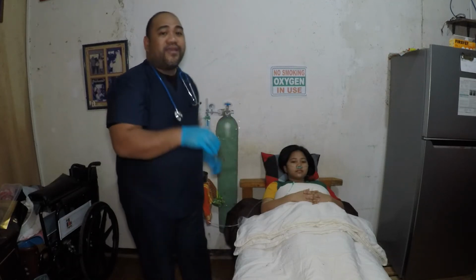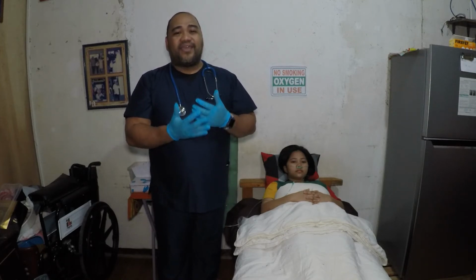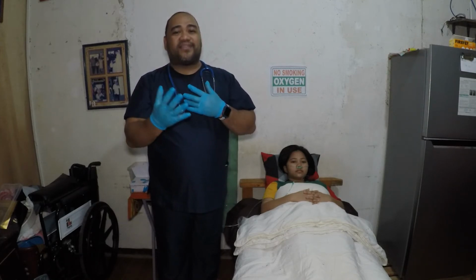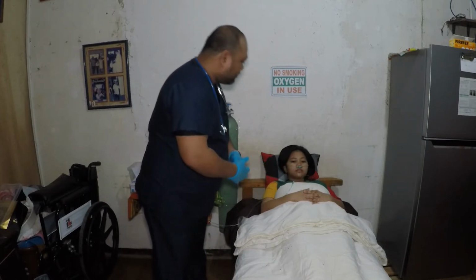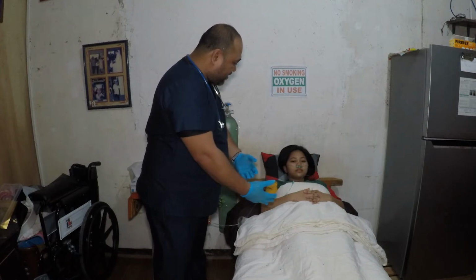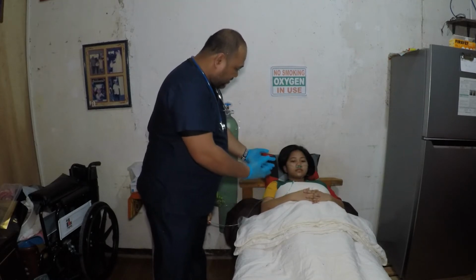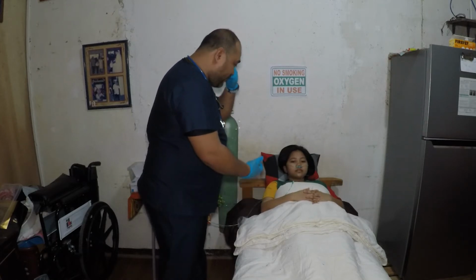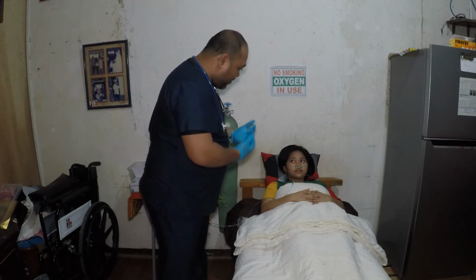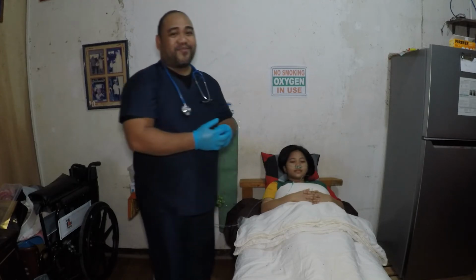Then also encourage the client to breathe through the nose rather than the mouth, and exhale through the mouth. Breathing through the nose means inhaling more oxygen. Ma'am, can you please inhale through your nose? And then exhale through your mouth. Inhale through your nose. Exhale through your mouth. So are you feeling better, ma'am? Can you breathe properly now with the help of the oxygen? Okay, thank you so much.